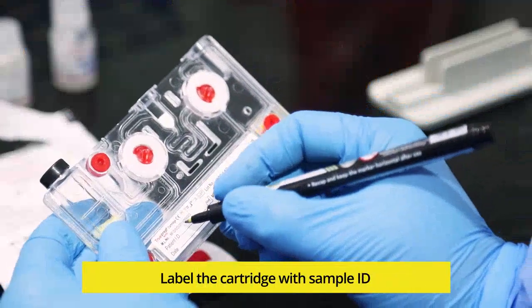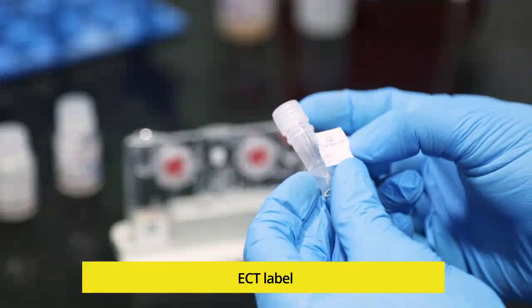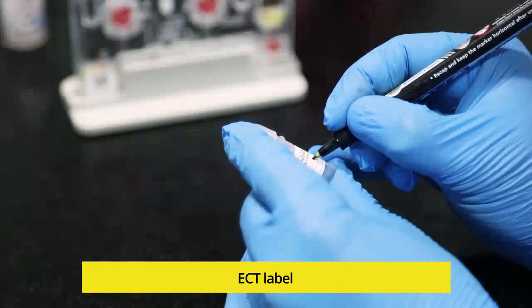Label the cartridge with the sample ID using a marker pen. Also label the elute collection tube with the sample ID using the label sticker provided in the pouch.